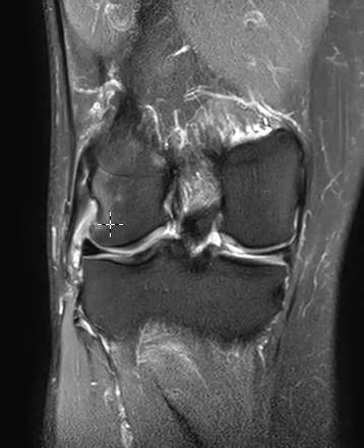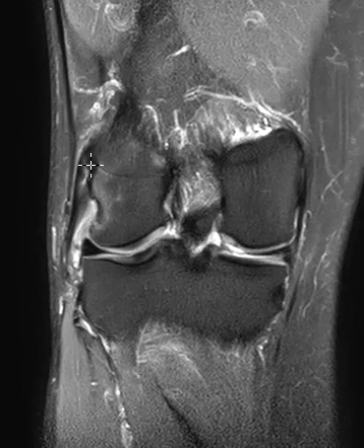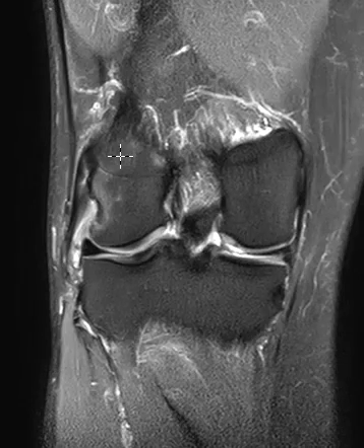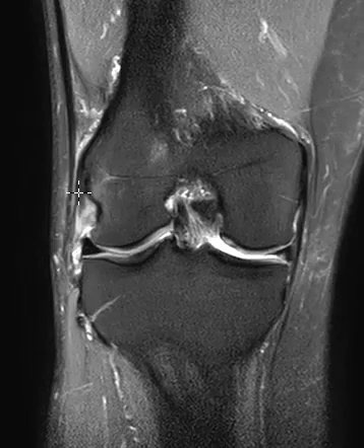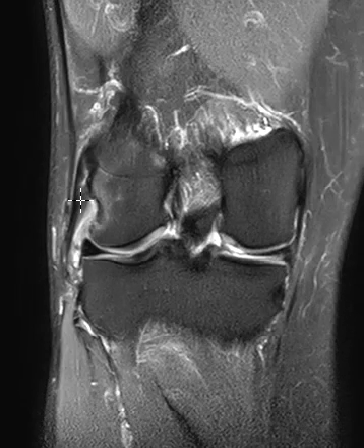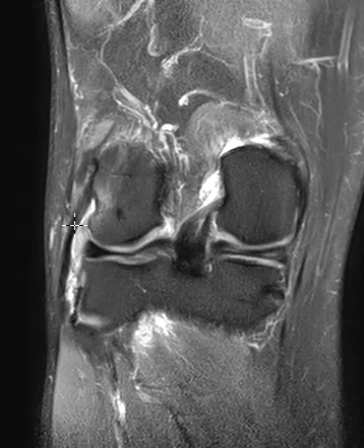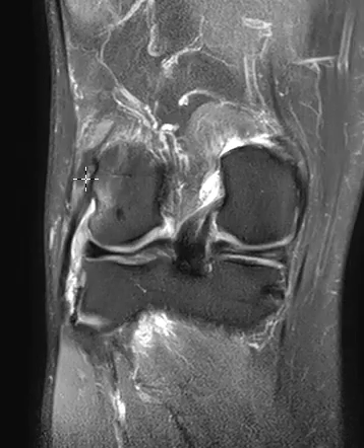Now we're going to look at the lateral collateral ligament complex. This part here is called the fibular collateral ligament — it comes off the femur, the lateral femur. This dark band coming down is the fibular collateral ligament, and you can see that at the origin there's a vertical band of bright signal — a linear, longitudinal intersubstance tear right at the origin. Not completely torn, but definitely abnormal. Further down it looks completely normal in signal — so just a partial tear at the origin.